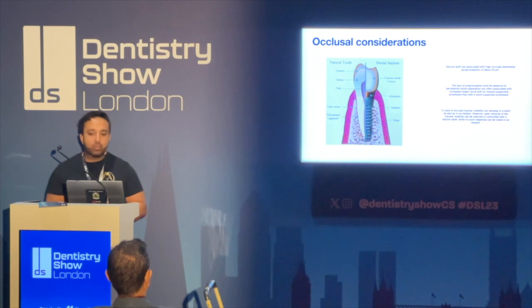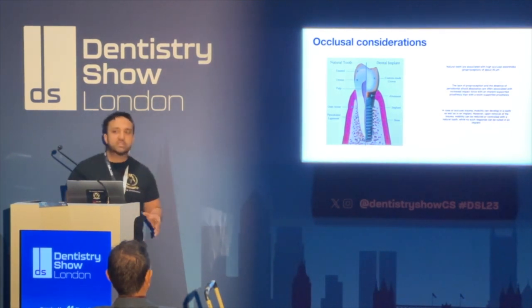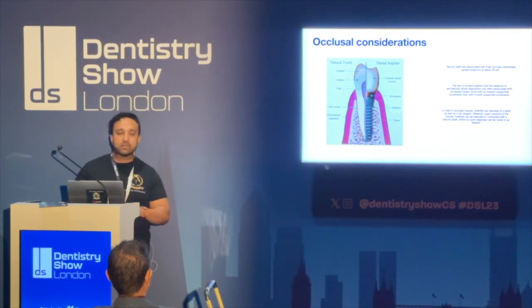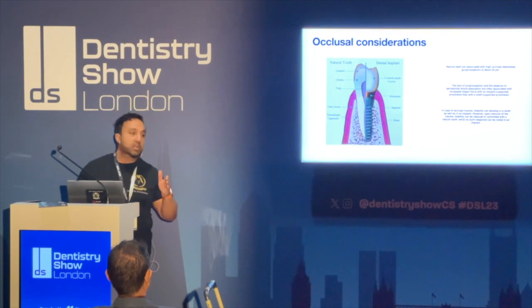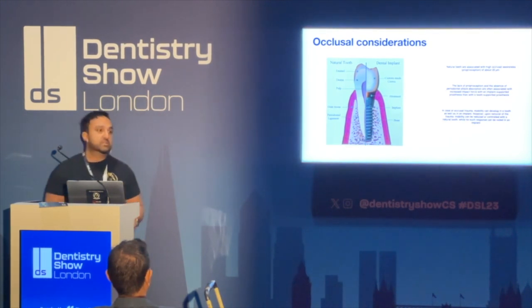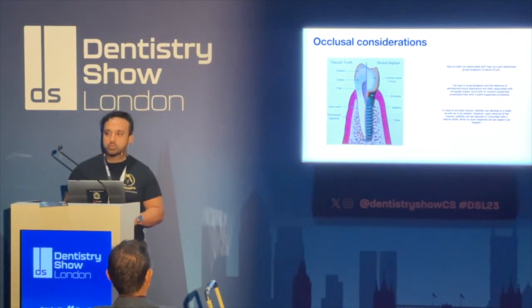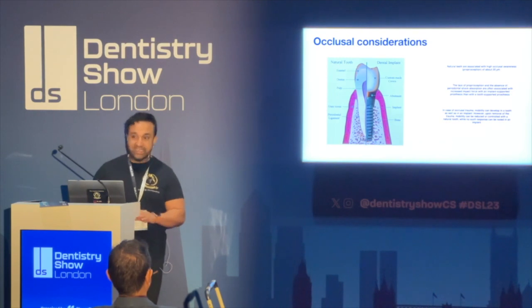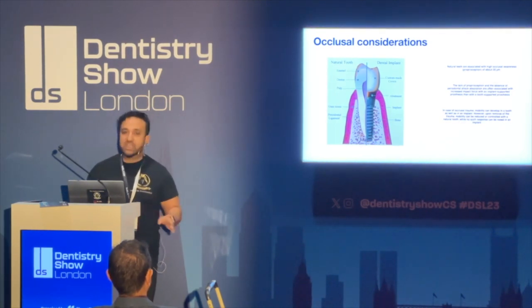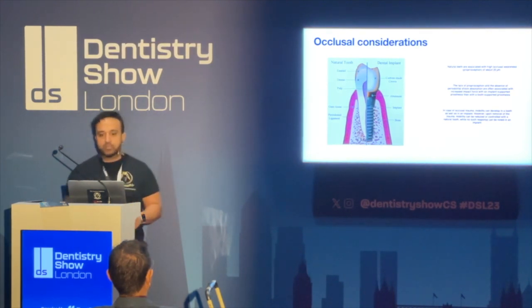And always look at, when you're referring, why does the patient need an implant in the first place? Implants are not a replacement for root canals and crowns. We've established in the profession that implants are for missing teeth or terminal teeth. They don't replace teeth because the patient goes, oh, I don't want a root canal for 3 hours, thank you very much, I'll just have an implant. No, we don't do that. It's unethical, it's indefensible, number one. A natural tooth will outlast an implant all day long. So if you can save a tooth, preferred.